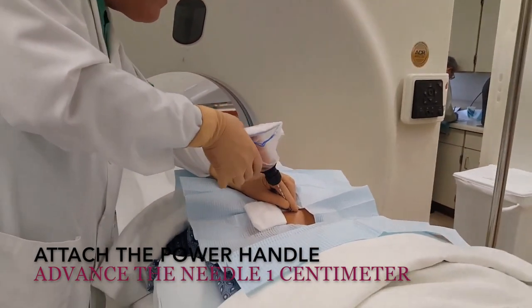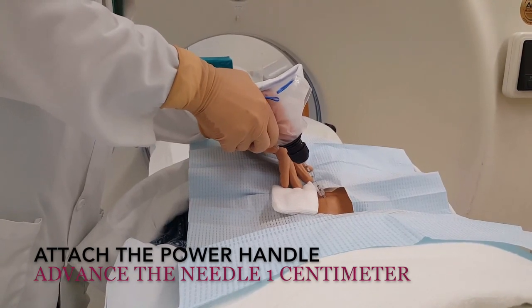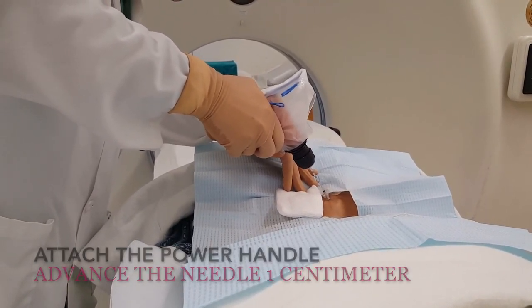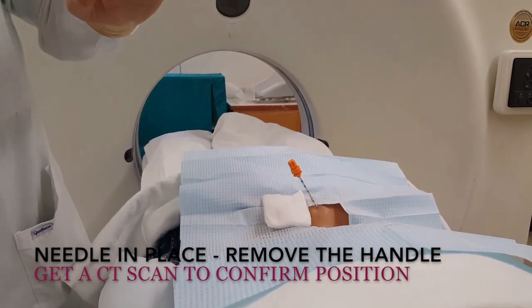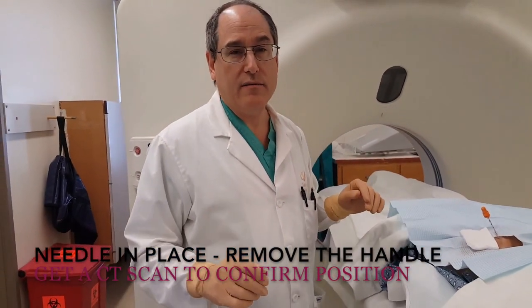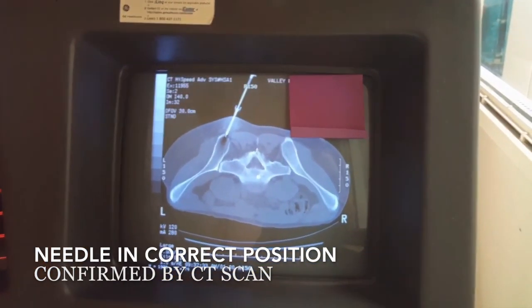I attach the power handle. We can go in a little less than a centimeter here. So now we're in place. Now we're going to get a CAT scan to make sure it's in the exact location that we want it to be and the angle is correct. The tip is just through the cortex actually.